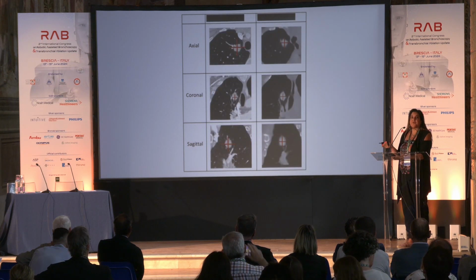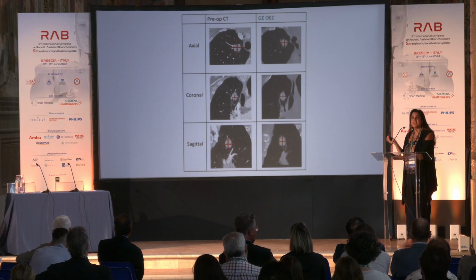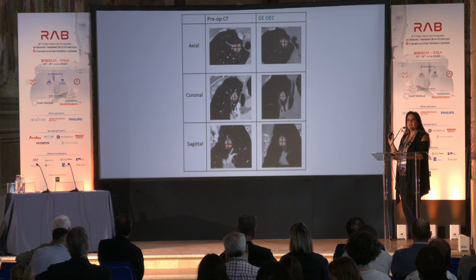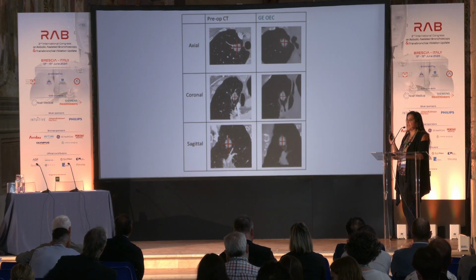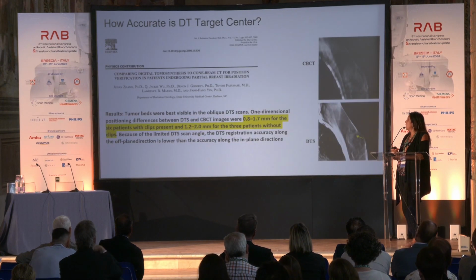This is even a different platform that a lot of you may have out there. Again, pre-op CT, and this is your GE. Again, not a full spin. This is a tomo spin from 30 to 30. Again, you very clearly and nicely can see your lung nodule.